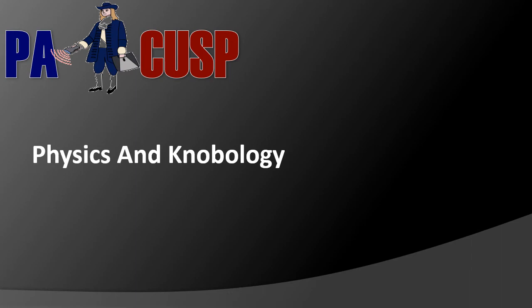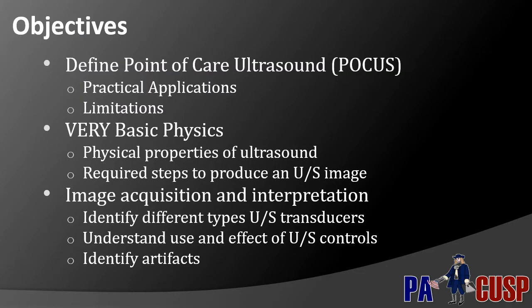Welcome to the PA CUSP Physics and Knobology lecture. In this lecture, we're going to define point-of-care ultrasound. We're going to cover some very basic physics. We're going to go over the basics of image acquisition and interpretation.